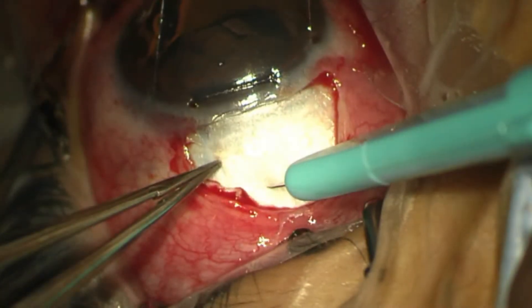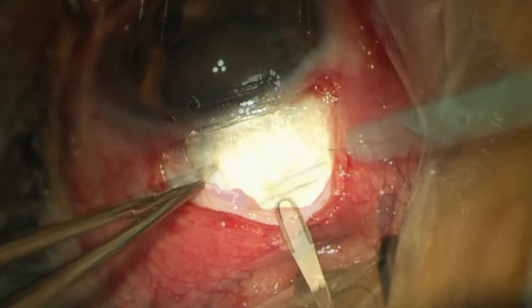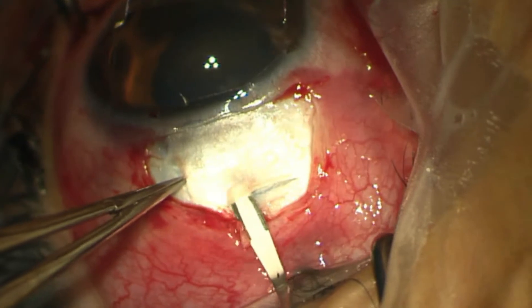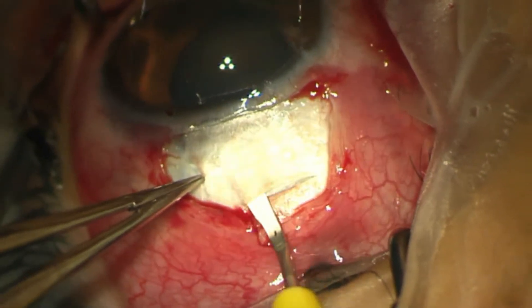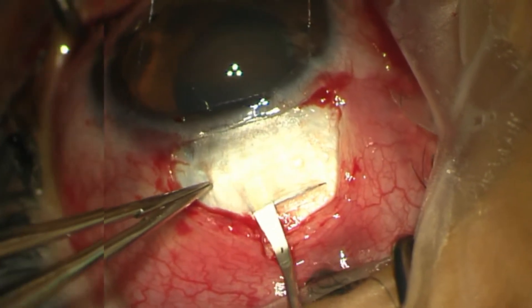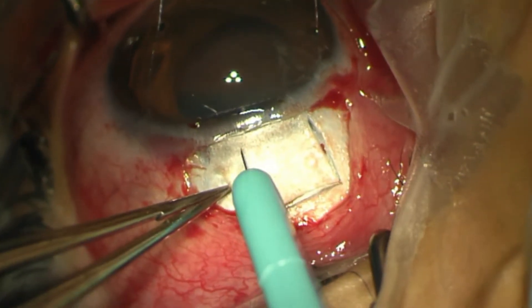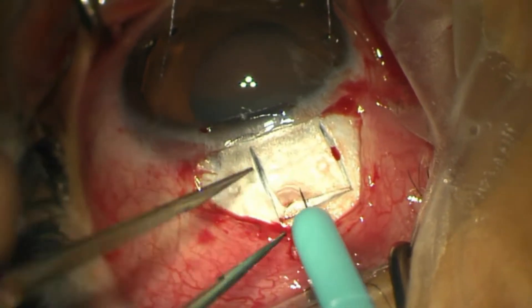We fashioned the superficial flap by creating the horizontal incision with the super sharp blade, followed by the crescent knife, dissecting the area in a circular manner in a pocket-like fashion, and then cutting the edges of the flap.